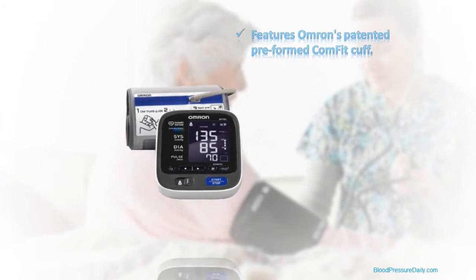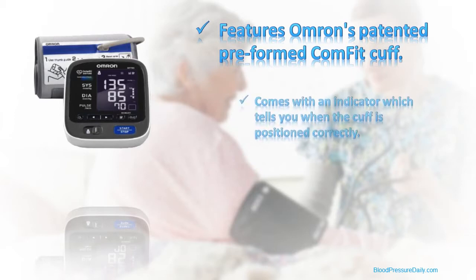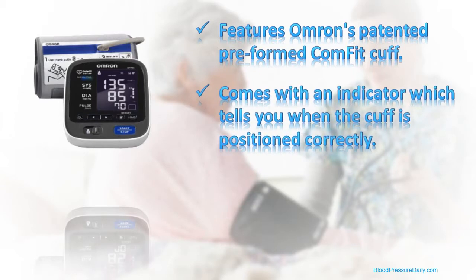The 791 uses Omron's patented preformed Comfit cuff, which is designed to fit arms from 9 to 17 inches in circumference and to ensure that you're comfortable while readings are being taken. It also features an indicator which will provide you with confirmation when the cuff is positioned correctly on your arm.